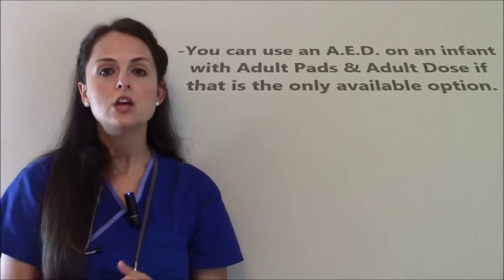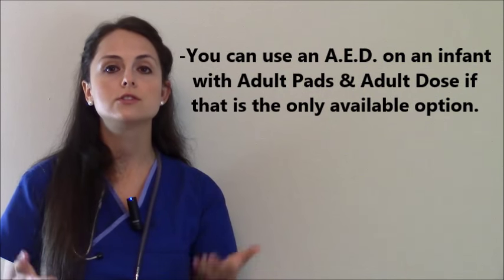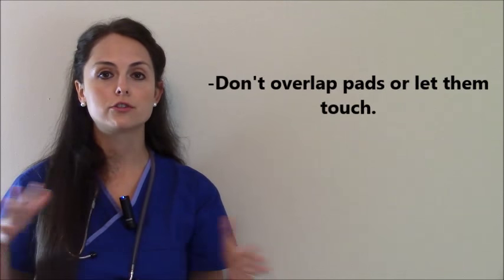Say that there's a situation where you get an AED and the only thing available for you to use are adult pads, and your AED does not have a pediatric attenuator. You can give an adult dose to the infant using adult pads. The key is just not to overlap the pads — make sure that they're not touching.